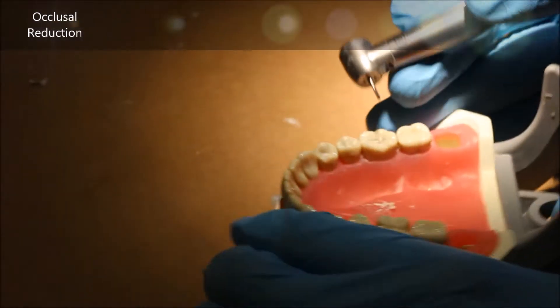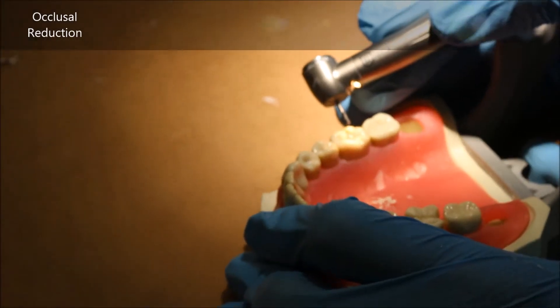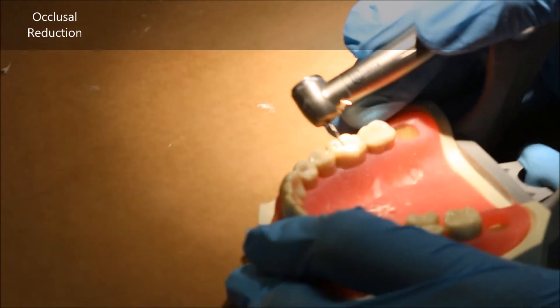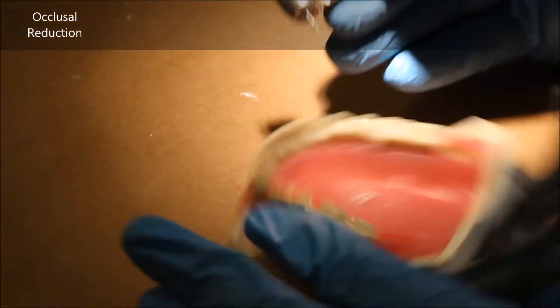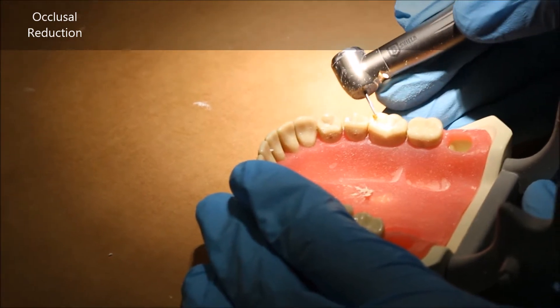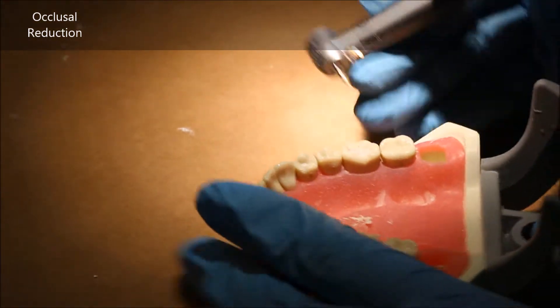When doing a full gold crown prep such as this one on number 30, the first thing you're going to do is occlusal reduction. Occlusal reduction takes down the entire occlusal table by one and a half millimeters in order to make enough room for the gold of the restoration.